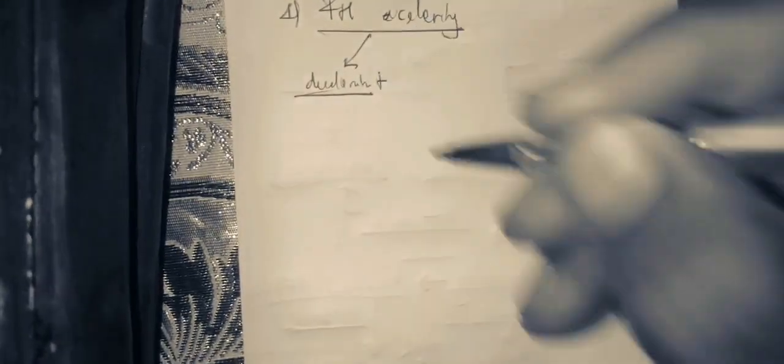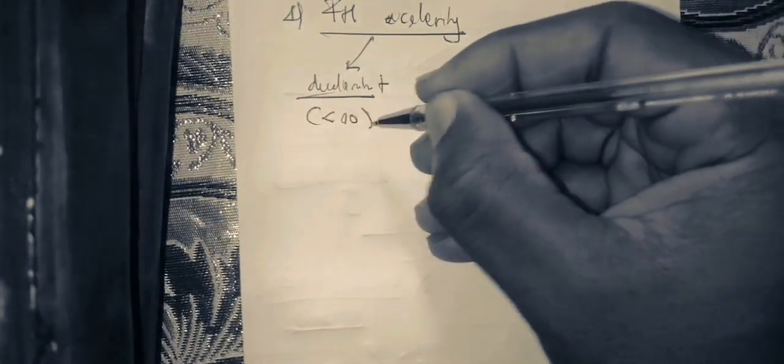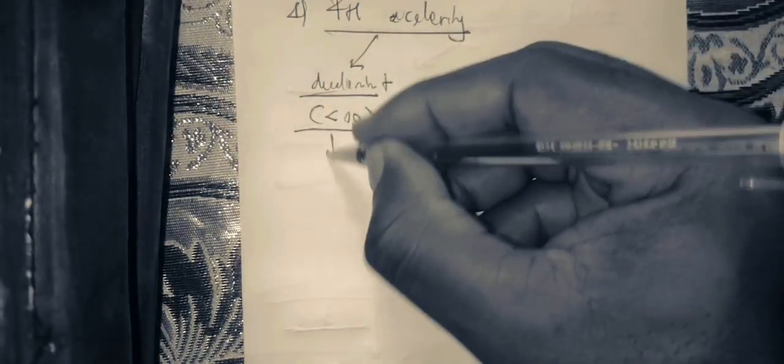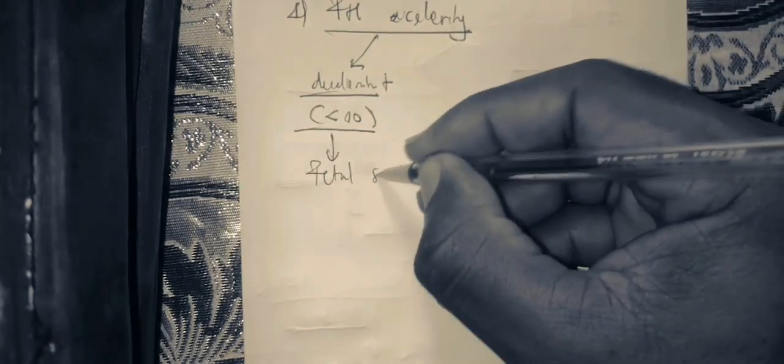Is it clear? So what are the different relevances of all these fetal parameters? The first one is, let's talk about the fetal acceleration and the fetal deceleration. In the fetal deceleration, if there is a fetal heart rate deceleration of less than 10 beats per minute, it means that there is usually a fetal sleep.